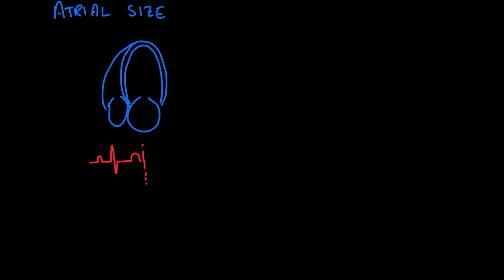And for the right atrium, we are just going to trace this area here. And so that area should be less than or equal to 18 square centimeters. That would be a normal right atrial size. Well, what about for the left atrium?